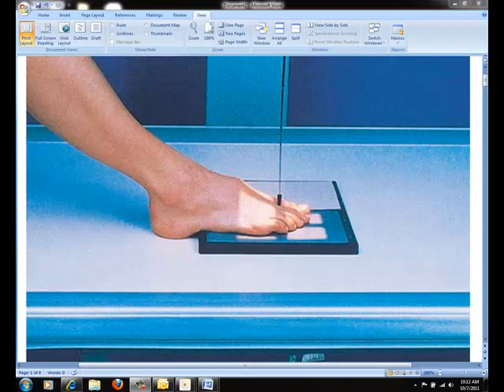Typically using an 8x10 cassette, you can place it underneath the patient's foot. With the patient in the supine or seated position, flex the knees and separate the feet about 6 inches.